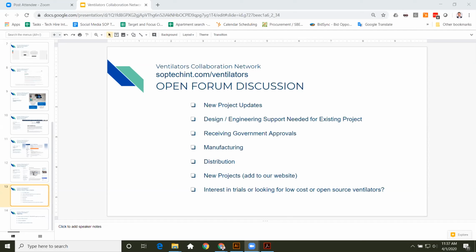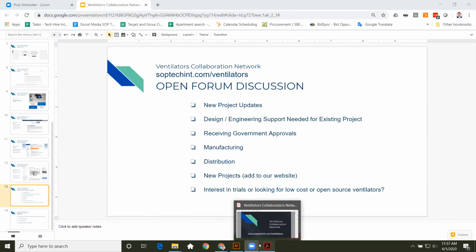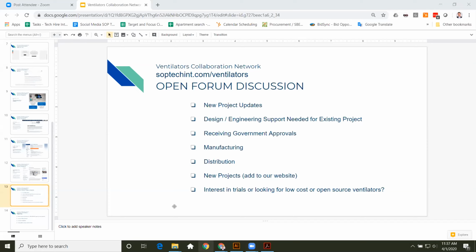I just want to suggest, and I'll leave it at that. Once we get a design, we need to get parts identified, because nobody's going to accept a product that's running a toy computer board or something like that. You're going to have a board that's assembled with some QA. And I know most people on here know that. I'm not opposed to the prototypes running those. Obviously, that's an inexpensive way to get the mechanical design thrashed out, but we got to get past that.